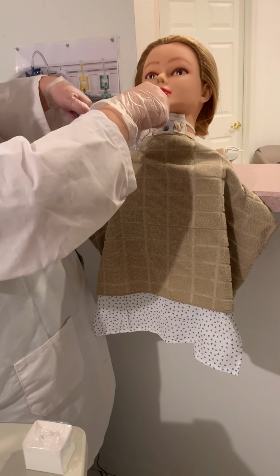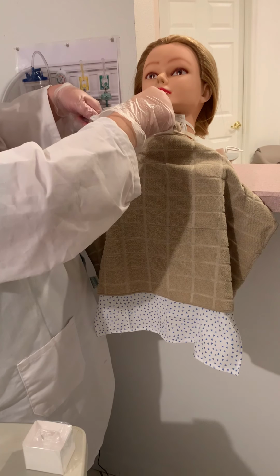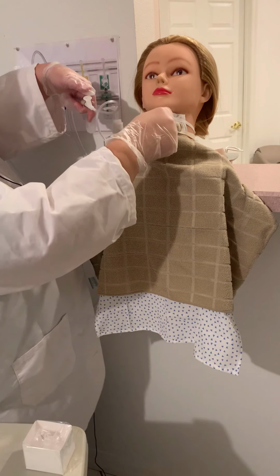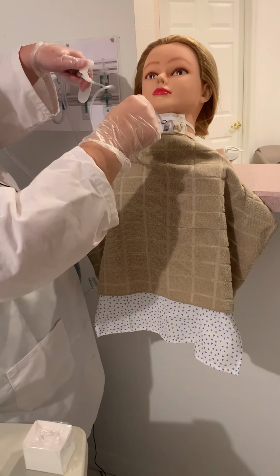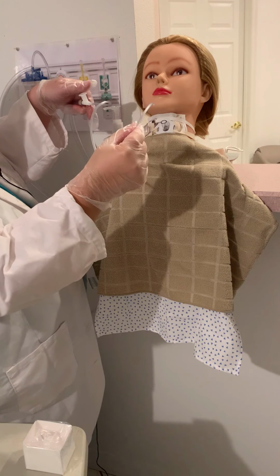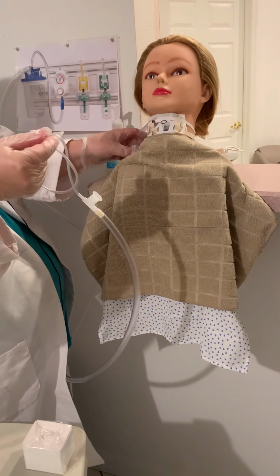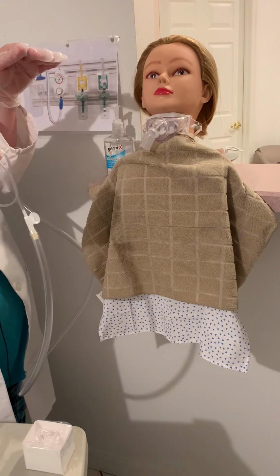So we're going to go ahead and put that tube in there. Going to go about 4 inches. So when I meet resistance or the patient coughs, okay, then I'm going to pull it back about 1 centimeter. Watch for any signs of respiratory distress. And I'm going to start tapping my thumb on here while I twist coming out. Okay, and I don't want to take any more than 10 seconds suctioning. All right, so once I pull that out, I'm going to kind of coil this up again so that I have control of where my tubing is. We will set the mask back on there with our contaminated hand.